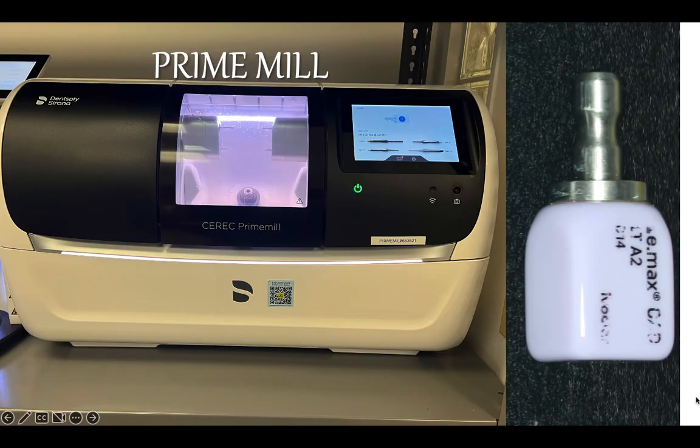And this is the Prime Mill. This is the new machine for the CEREC. This is the new milling machine for the Primescan. You are going to have this machine also next to the Planmeca. We are going to have all of them together, but this is not the one that we are going to use unless you are in grad operative doing an aesthetic case. Okay, observe that this is not a hexagonal or a rhomboid or diamond shape. This is just a circle, a cylinder. So those blocks go in here.